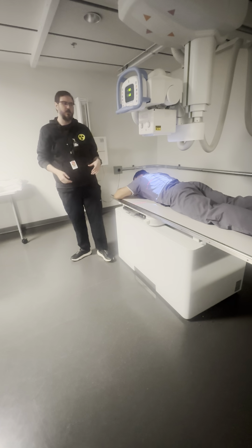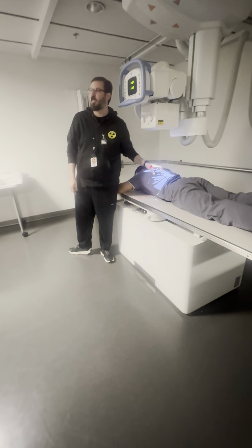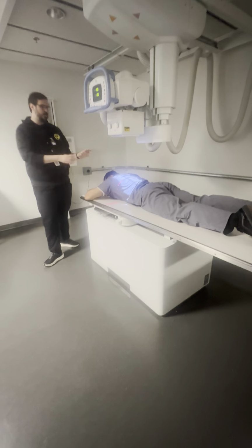The other way is also crazy, when they're hyposthenic and the stomach makes a U and dips down really low. You'll still be good because you went down low enough to fit all of that in there. So a little bit of extra intestine never hurt anybody in the picture, right? So that's going to be your first shot.